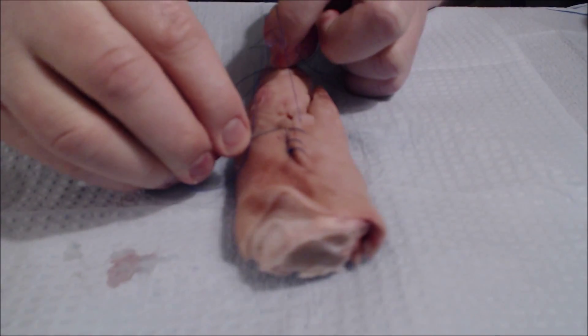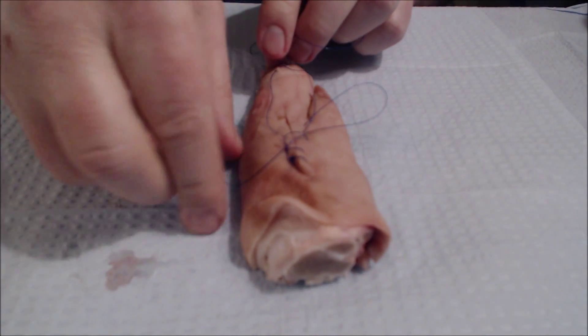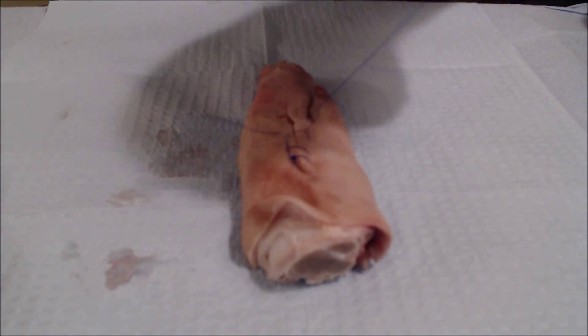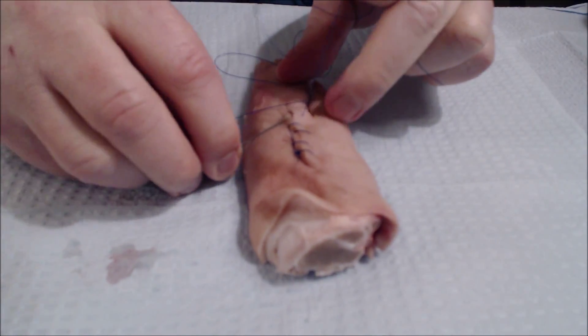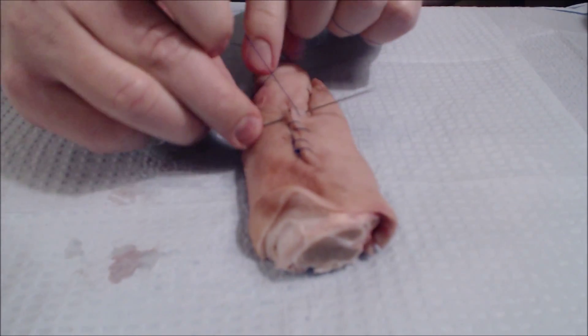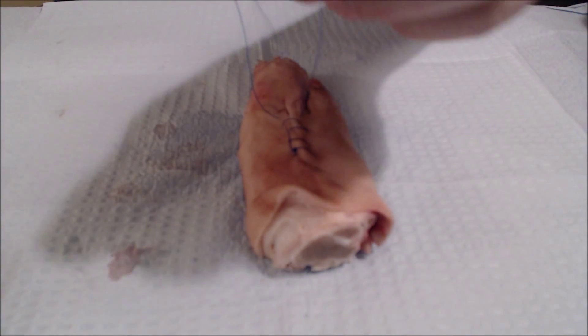After a while you can help pucker up the edges by pulling up on the suture material, and this helps keep it tight as you're proceeding down the closure. You try to keep the needle equidistant from the incision.